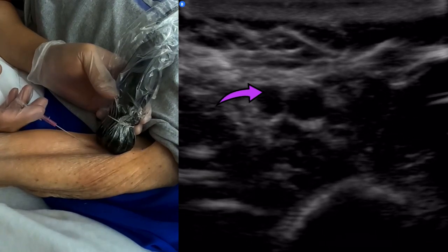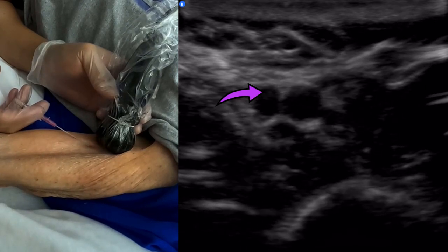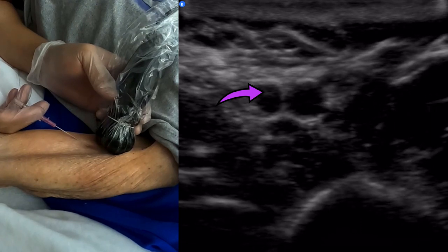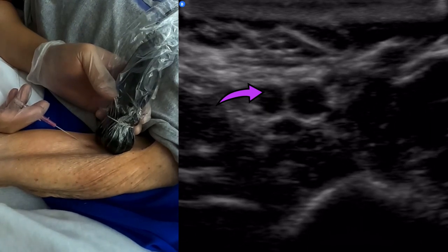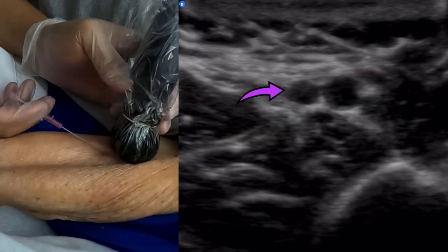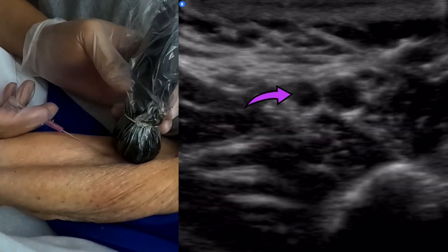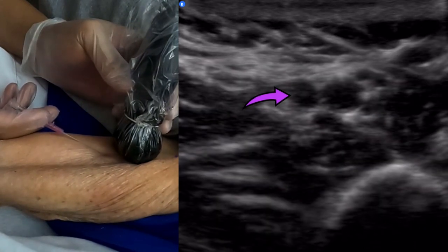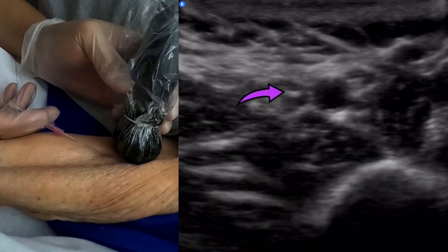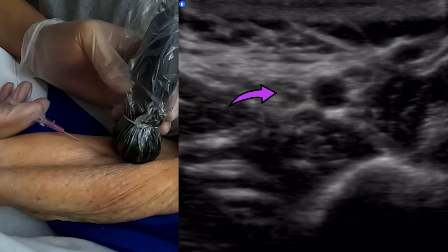Almost punctured the artery there, so I'm trying to be careful not to. And some of y'all are saying, how do I keep my left hand, my probe hand, steady? Look at my points of contact. The back of my fingers, my forearm, my hip. There we go. So you want multiple points of contact so that your probe hand doesn't slip unnecessarily, or slip when you don't want it to.